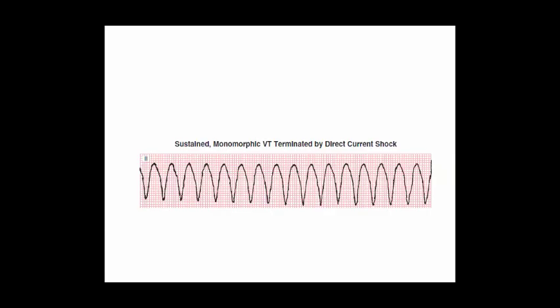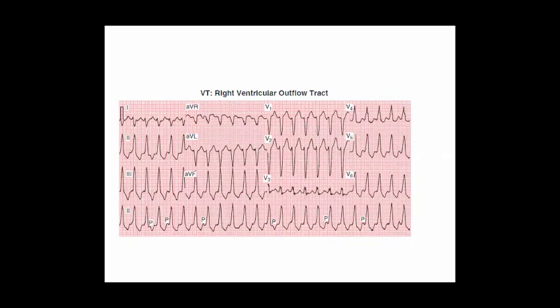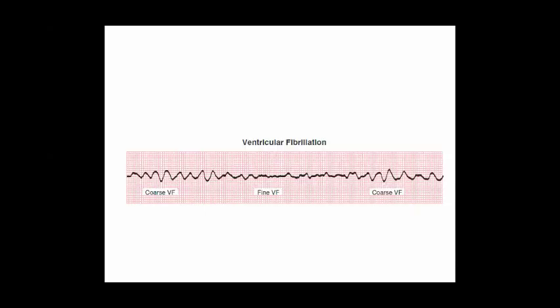This tachycardia may be pulseless and need immediate resuscitation. And any wide QRS tachycardia that's recorded is mostly ventricular tachycardia. In my knowledge and my practice, I almost always diagnose wide QRS tachycardia as ventricular tachycardia. This is a different type. Wide QRS tachycardia means ventricular tachycardia.